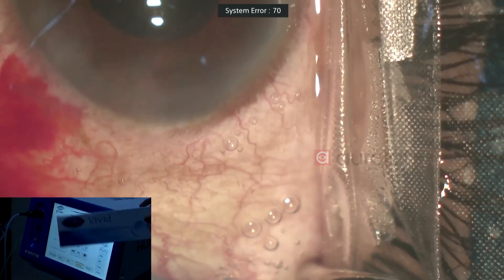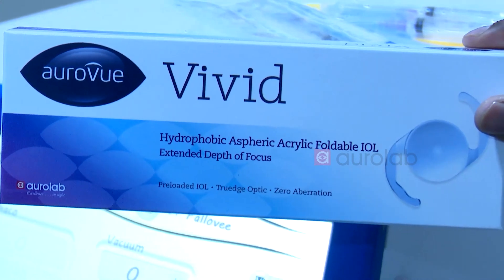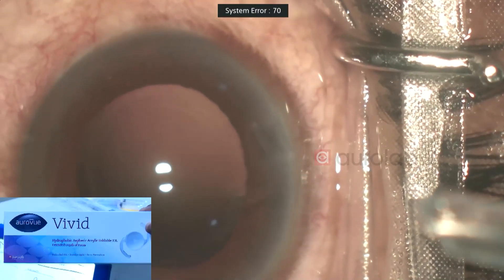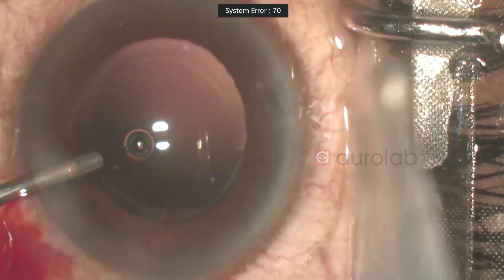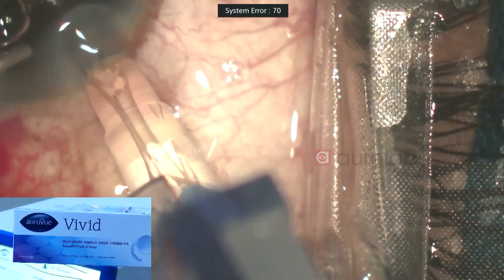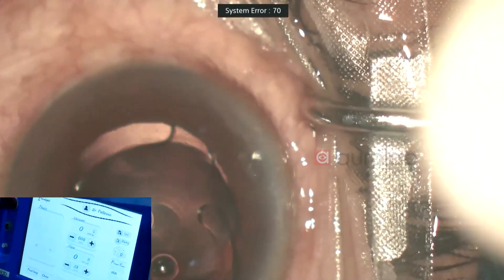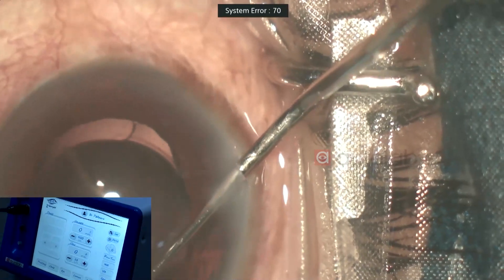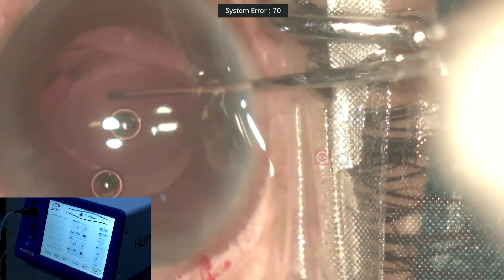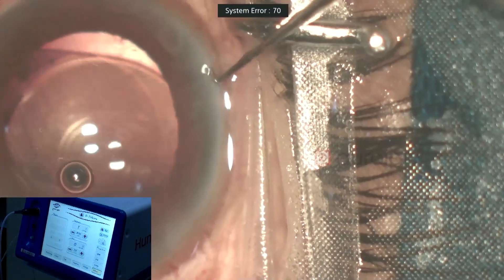I'll be implanting the AuroVivid. Just a bit of a wash and I'll center it. The AuroVivid is a hybrid lens — the center part up to 2.96 mm is where maximum near add is given, comprising a central refractive area followed by four rings for the diffractive. The refractive part has a 2.9 add and the diffractive part has a 2.1 add. One of the haptics is not in the bag — I'll just dial it in.